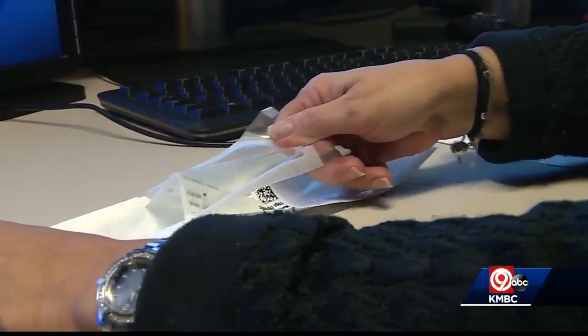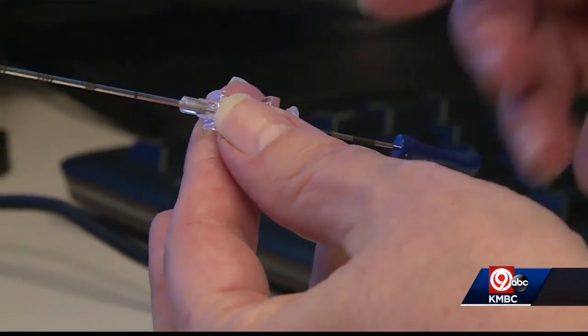Traditionally, that was done by placing a wire into the breast, which could potentially dislodge or be uncomfortable. AdventHealth's Shawnee Mission is now using a newer device they say is less invasive and more effective.